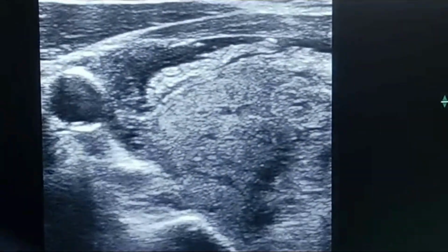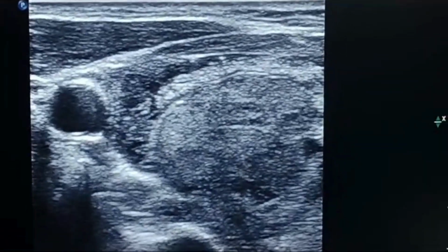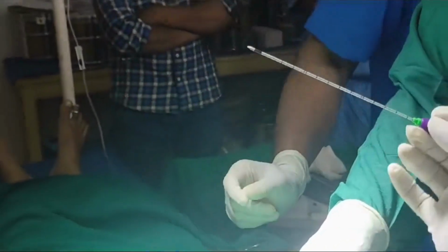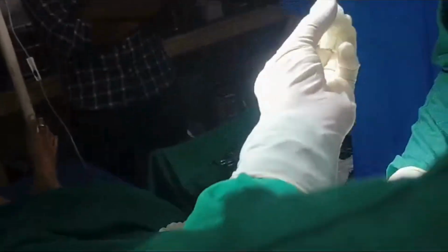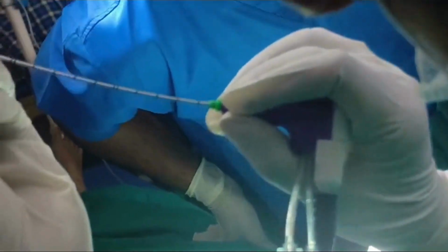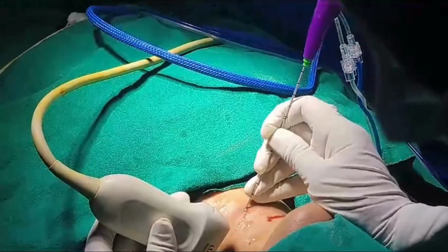Now the incision, please. Blade. Always use a 14 gauge needle. Before inserting, you have to check whether the antenna is working or not. It's stuck, it won't work. After 10 seconds it will get. First incision, make it in this direction.